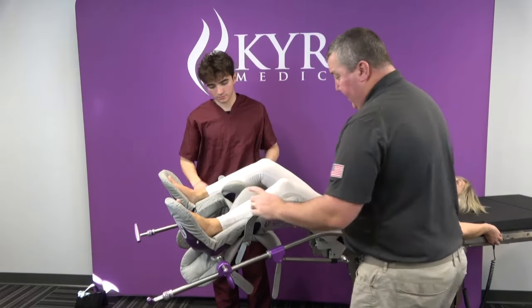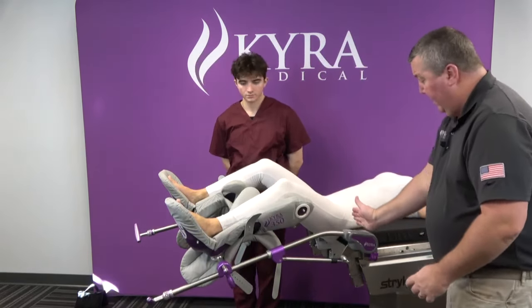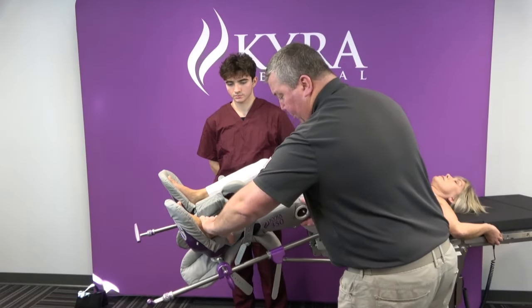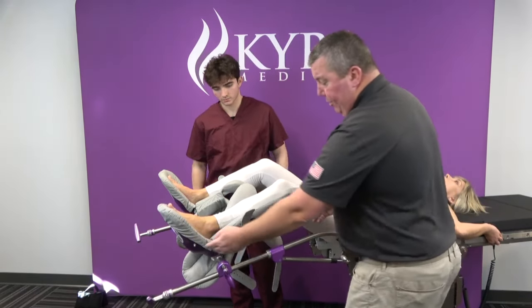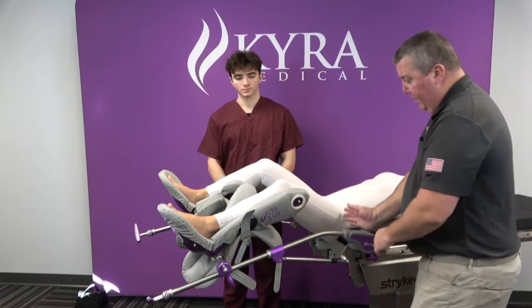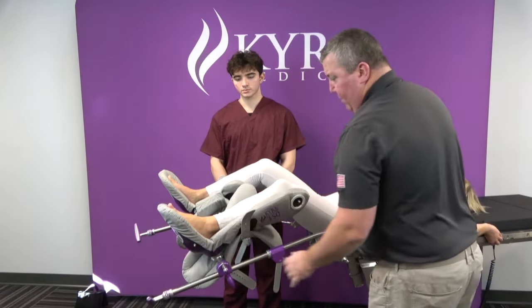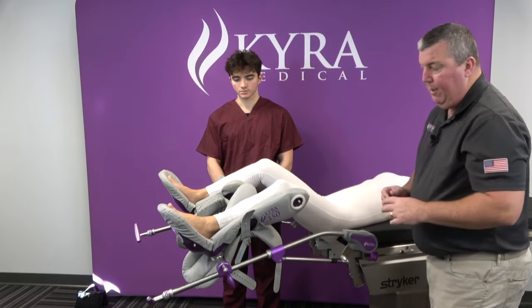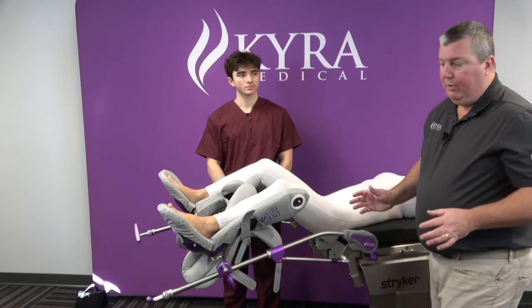The reason that is important is because I have this aligned to the hip, I have her ankle pushed into the stirrup boot, and I have the stirrup set to create a 30-degree angle for length. If you do those three things — align the hip, make sure the ankle is seated, and make sure there's a 30-degree angle — the leg cannot come out of the stirrup boot.